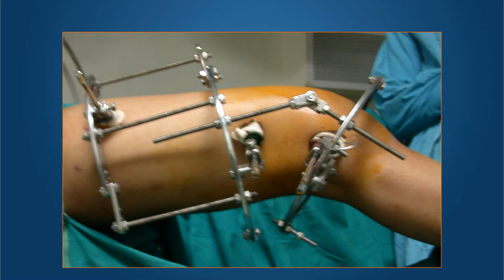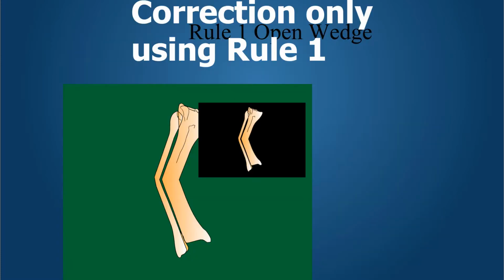So this is how we located the position of the hinge. We reconstructed the ring and placed it accurately on the patient's limb. The posterior motor distraction rod can be seen just disconnected before the corticotomy.